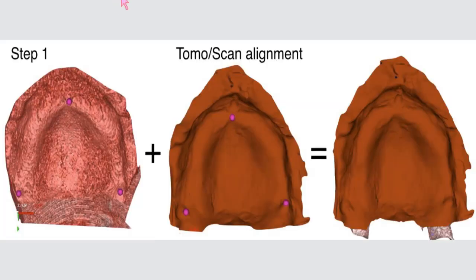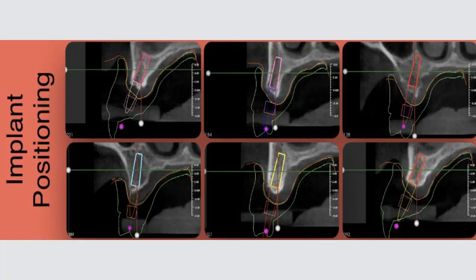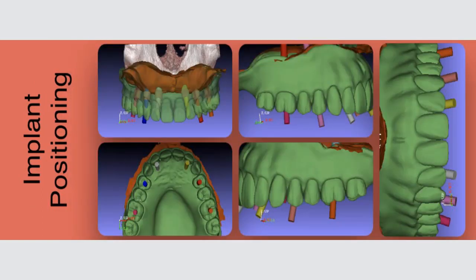So here you have the implant planning coming, because I have the denture, right? I have the CBCT, right? And then I have the scan of the tissue. What I will do is overlay all these files to design my restoration. This is how the software is developing. So I have the denture. And in my case, as I did a digital denture, the only thing I did was ask for the STL of that denture. So I have the STL in my hands. I have the CBCT, and I have the intraoral scan of the edentulous patient or an impression. Then what you do is overlay all this package and go for the design, the implant placement based on the existing denture. Bingo!